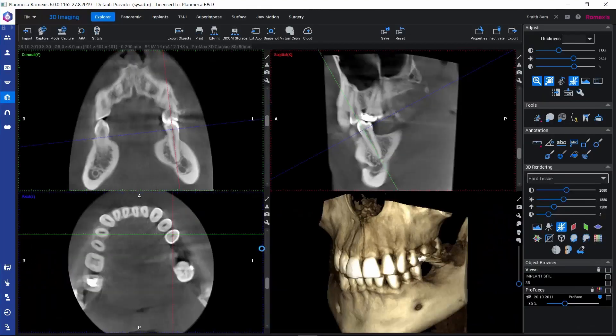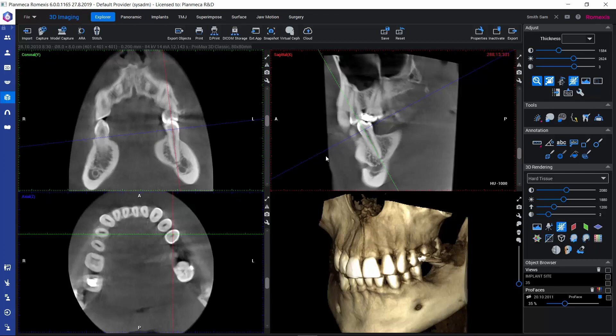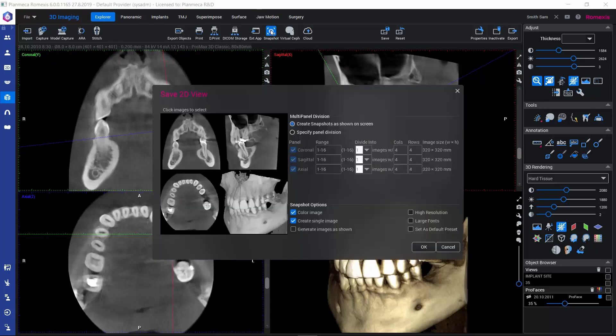If instead of saving only one of these views, we would like to save, for example, all four, there's another option to save 2D views. That's here in the upper toolbar called Snapshot. If we activate this, we get this small dialog where we can specify which views and in which way they would be saved as 2D images.